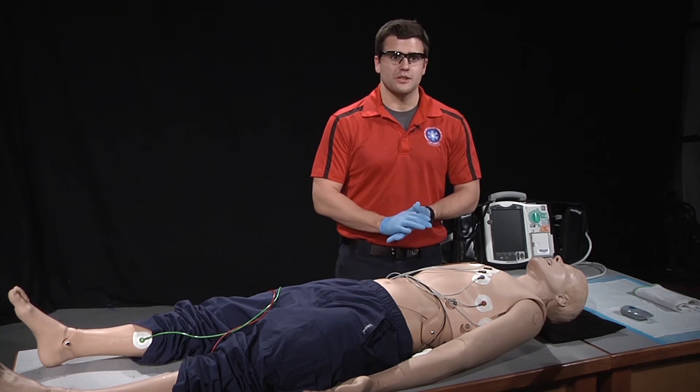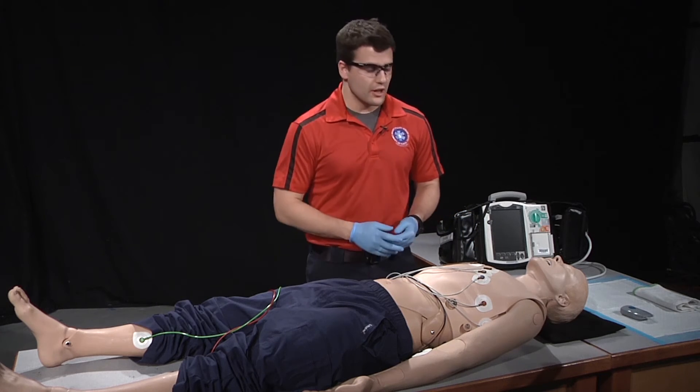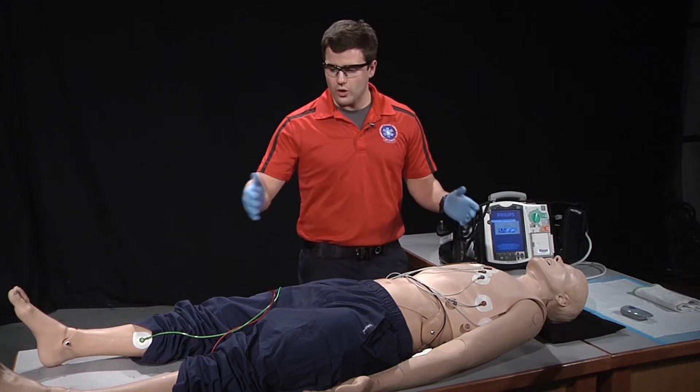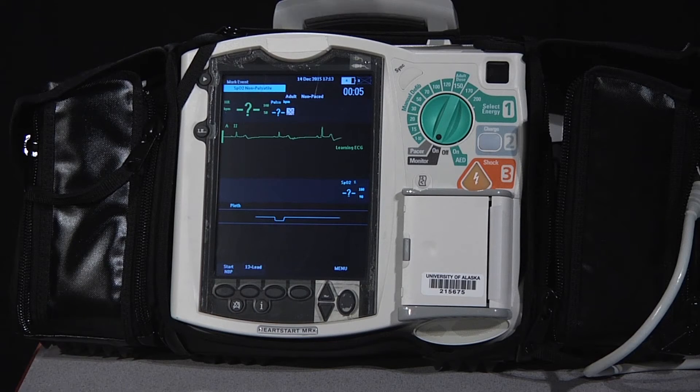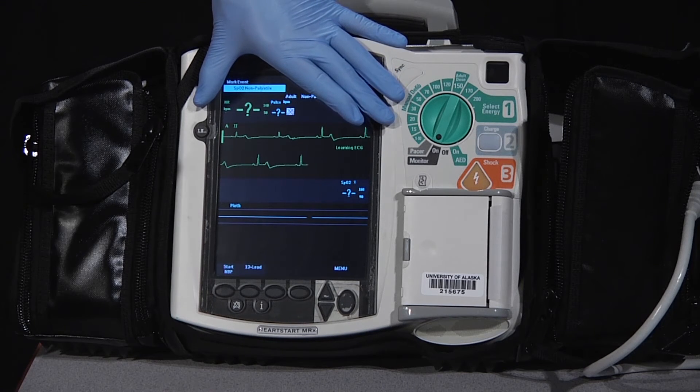After we've attached all of our leads, we want to make sure our patient is lying still, breathing normally with no talking. We're then going to turn on our cardiac monitor and ensure that all of our leads are placed and connected appropriately. We want to make sure that the picture we're receiving on our cardiac monitor is as clear as possible with a minimal amount of artifact.